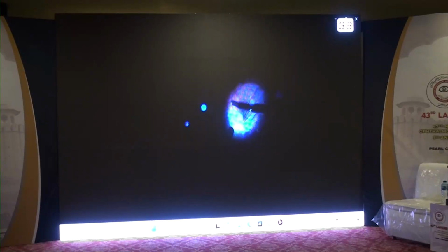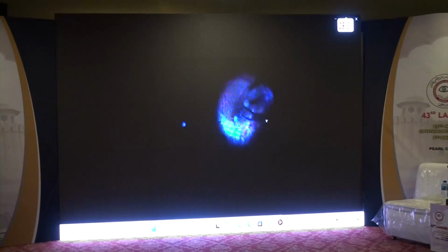This is a persistent epiretinal membrane. I was successful in removing it from one side, but as you can see, the free edge is very near the fovea, so we have to be very careful. And also, after retrospectively observing two cases that I did, it's better to keep the light pipe away from the surface of the retina. It induces the phototoxic effect of the light.